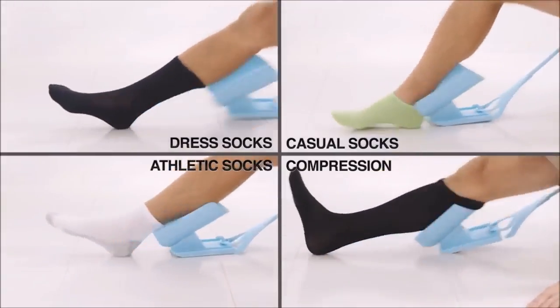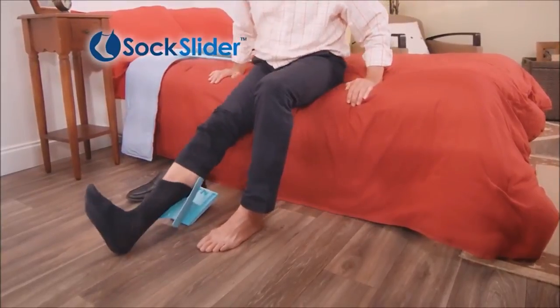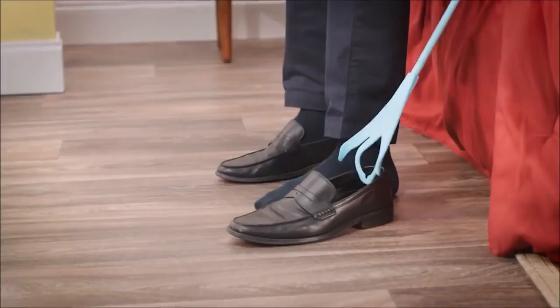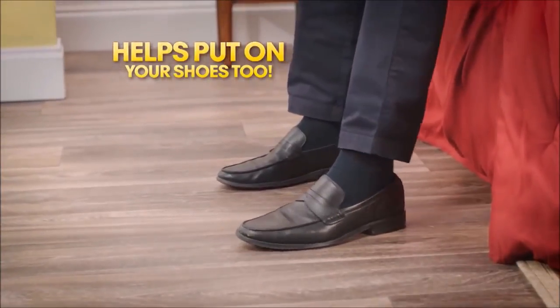Dress socks, casual, athletic, medical, or compression — all your favorite socks can be put on without frustration. Sock Slider is great for moms-to-be. Plus, it can be taken apart for convenient travel and storage. And here's something you need to know: the Sock Slider can also help put on your shoes and you're good to go.